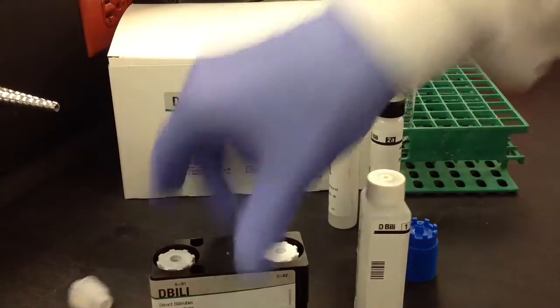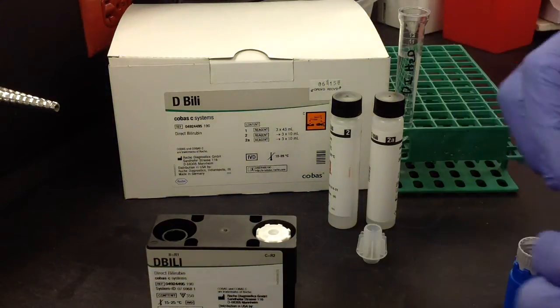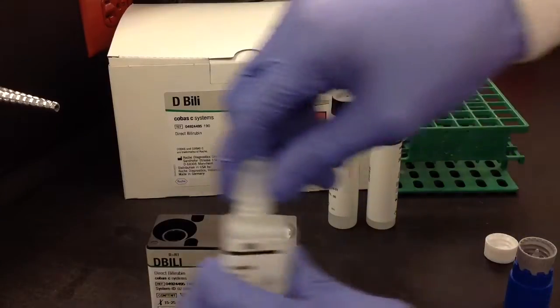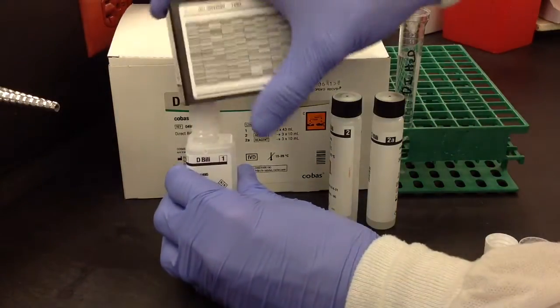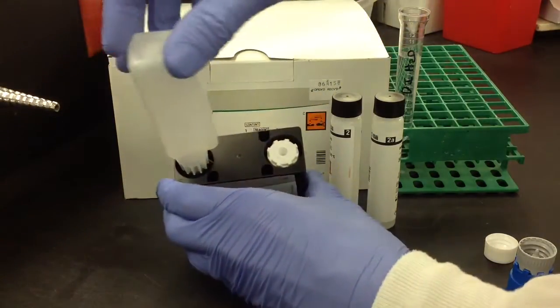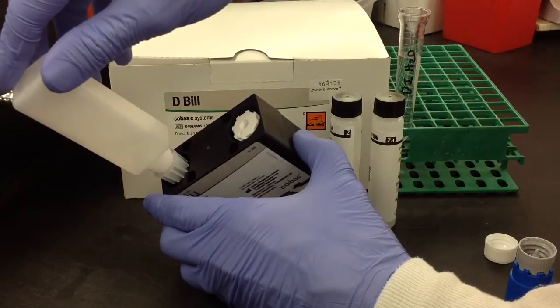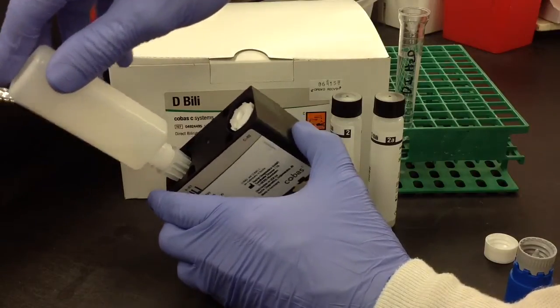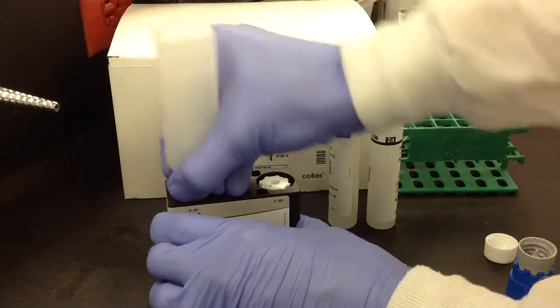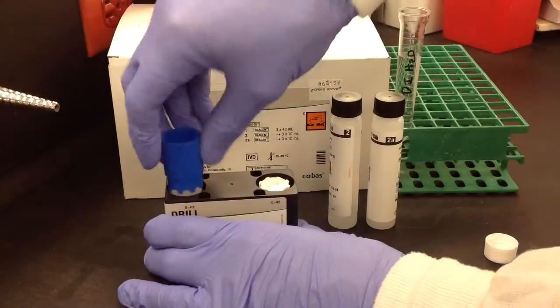First, go ahead and add DB121 — this reagent is already completely prepared — so just go ahead and remove the cap to the cassette, attach the connector, and then attach the cassette to the reagent and add it all to the cassette. Just make sure you get all of the reagent into the cassette; you can tap it around a little bit if you need to. After that, just go ahead and remove the reagent and then reattach the cassette cap.